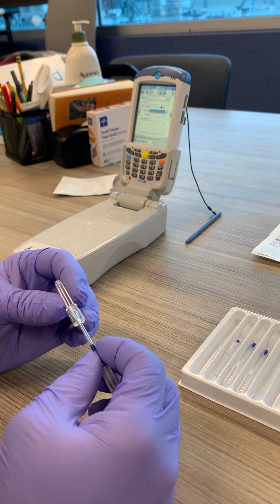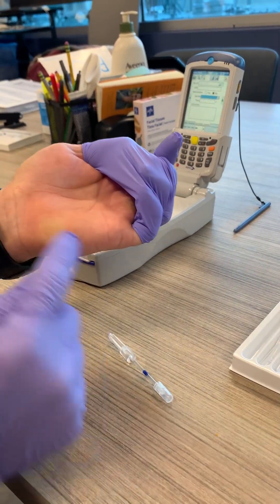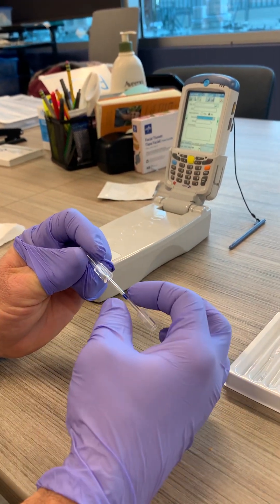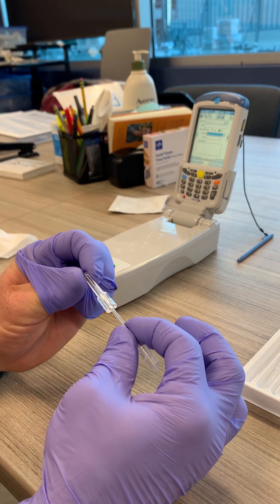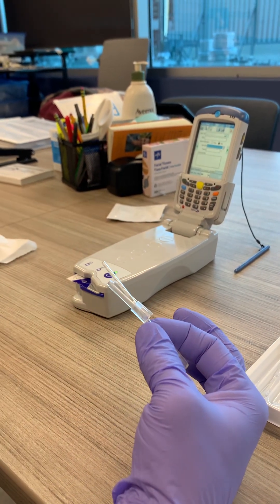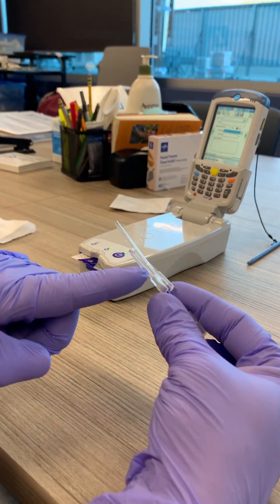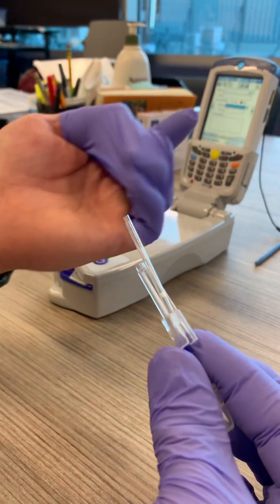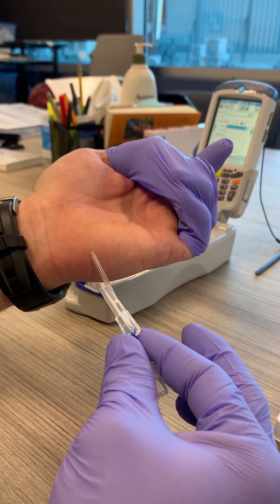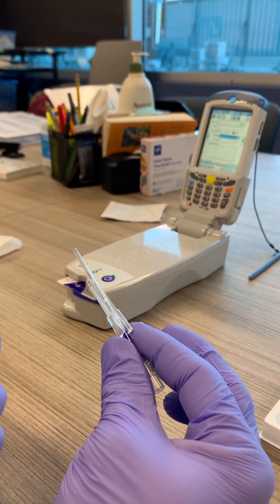When filling — for example, if you're doing a heel stick — when you poke the heel, hold it by the blue marker here. You're going to open this up and you'll see the capillary tube comes out a little bit. Down here there's another white marker, and that's where the blood is going to fill to. So as you're filling from the heel after you poke it and get the blood to fill, you're going to fill to that white marker right there.